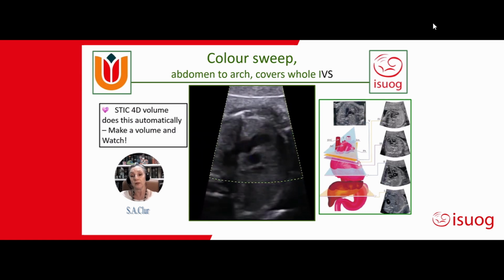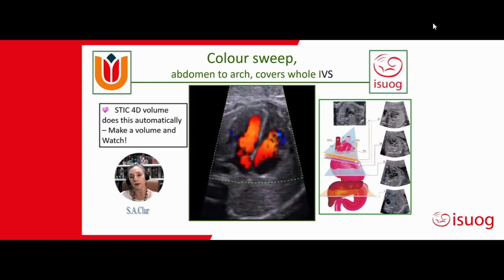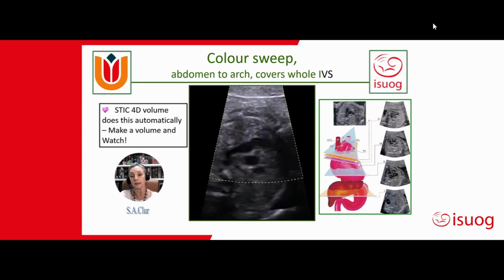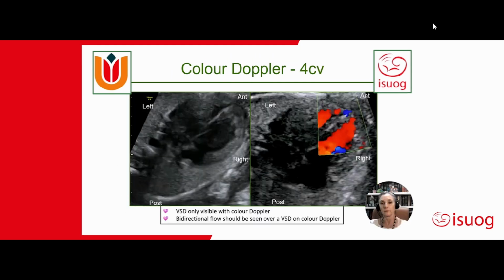So make a volume and watch. I found that a very good way to get an idea of the entire heart in a sweep, which can be with color or in black and white, of the entire fetal heart in a very short period.